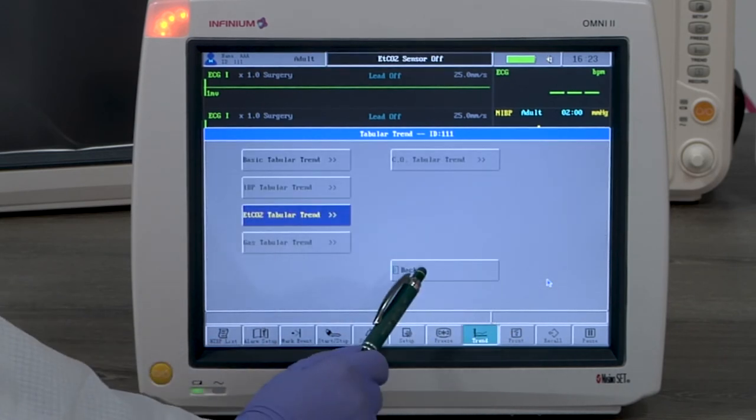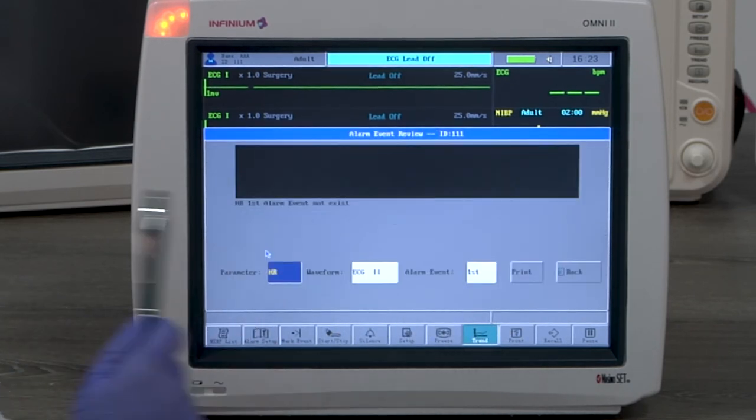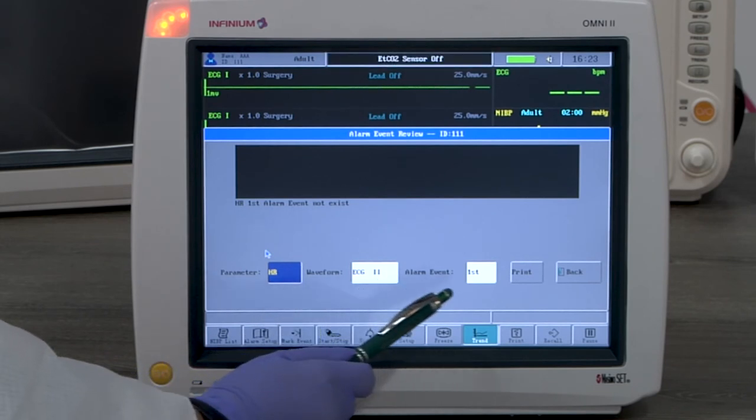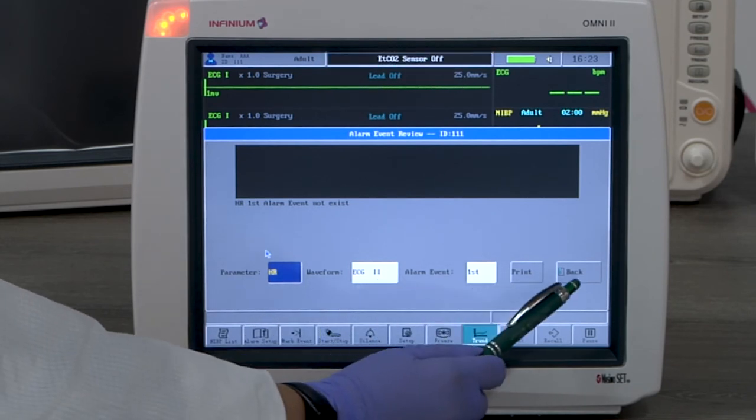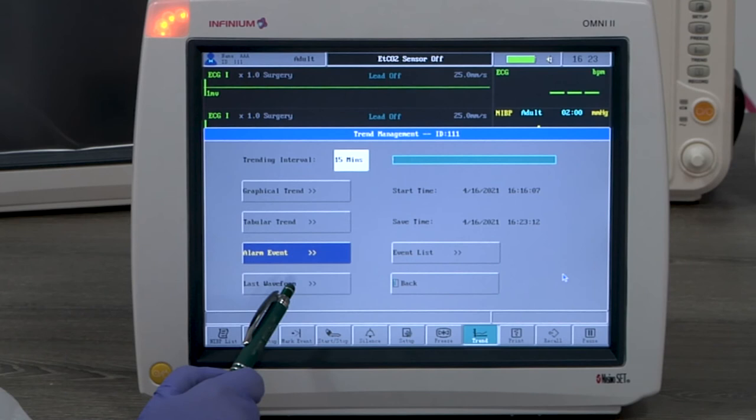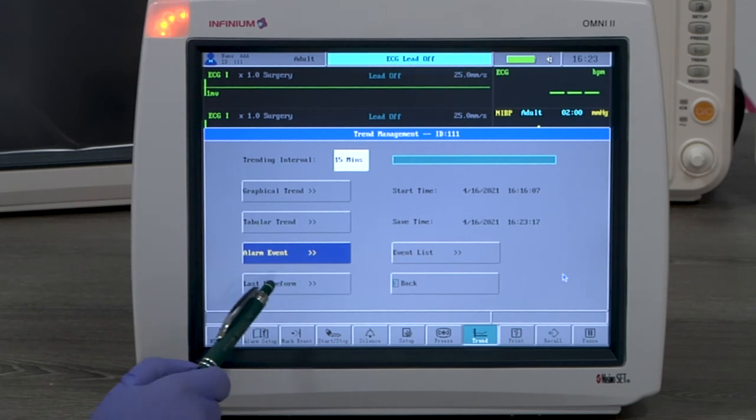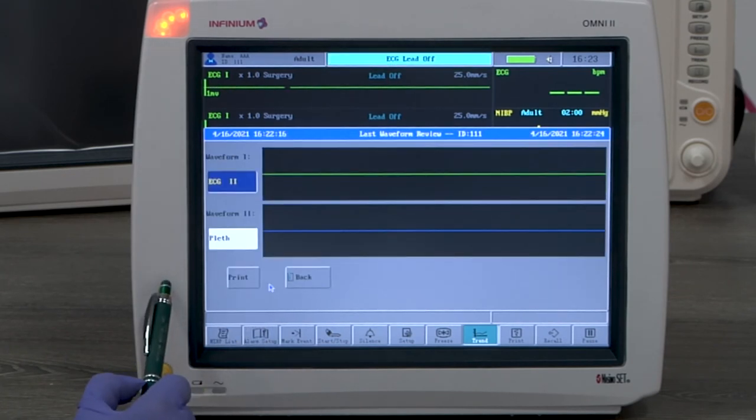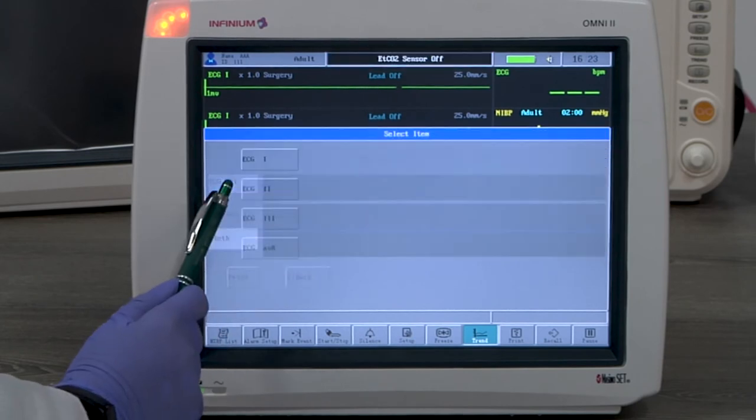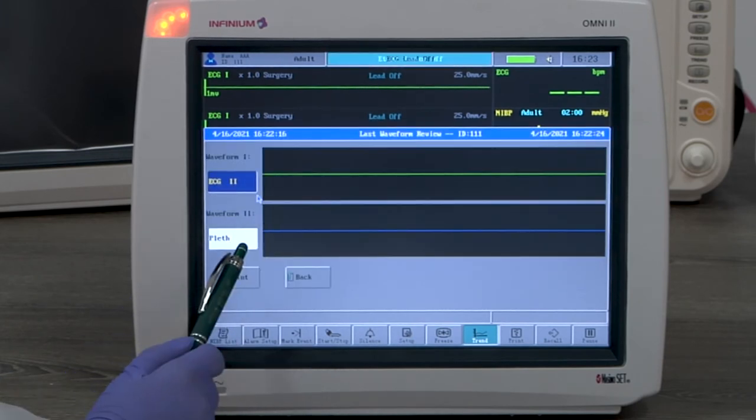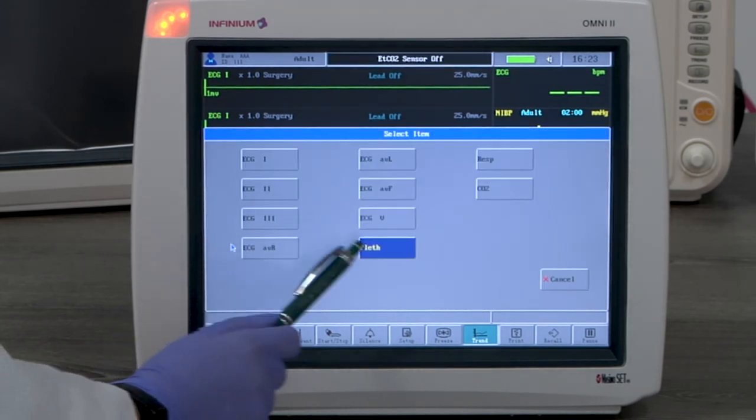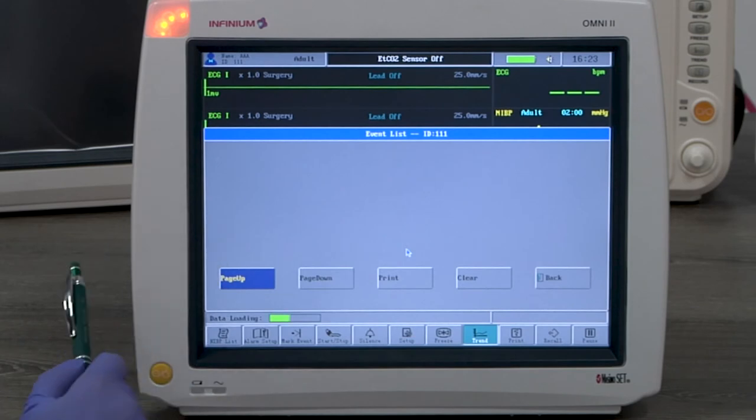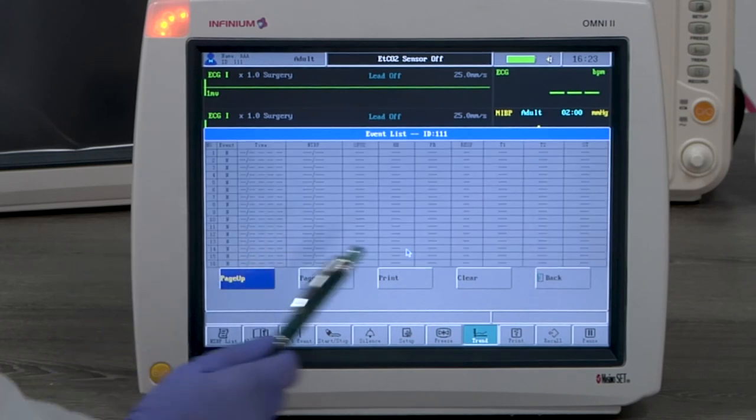Alarm event shows the history of alarms of the selected parameters and 8 seconds of waveform at the moment of the alarm, if available. Last waveform shows the last 8 seconds of the waveform of the selected parameter when entering trend management. Event list shows the list of standard parameter readings under each marked event.